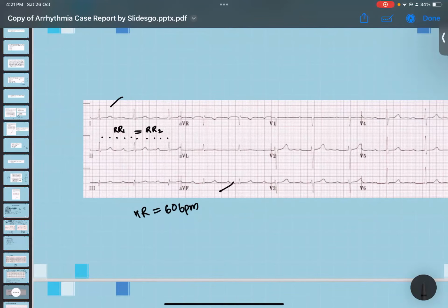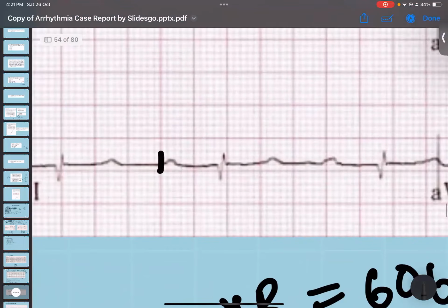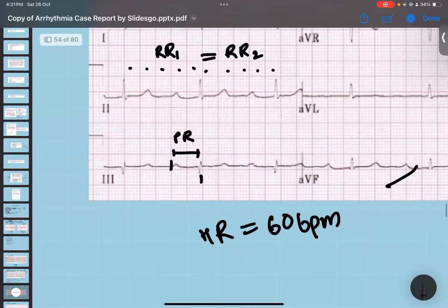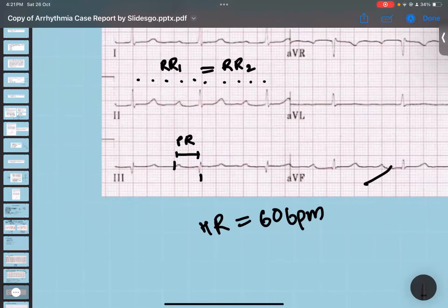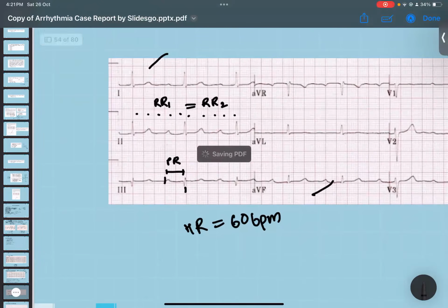Regarding the PR, QT, ST segments, as you can see, the P wave starts from here, and then it's supposed to end here. This is your PR interval, right? Clearly, it's way too long. It's too prolonged. So this is a prolonged PR interval. It's literally spanning 2 big boxes. So this is not a normal finding, okay? This is not a normal finding.